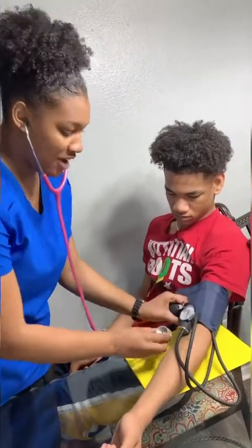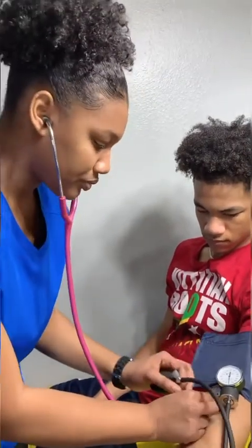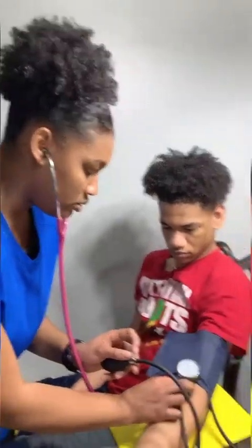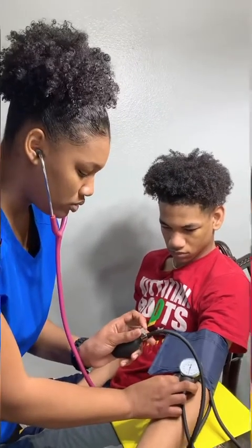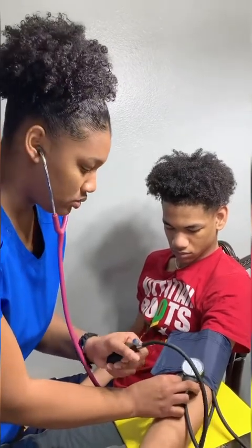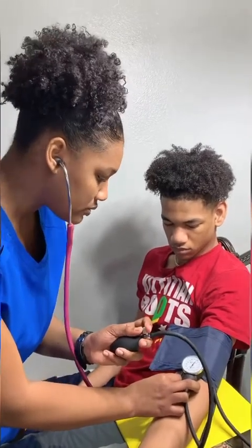So I'm going to have my stethoscope on the brachial artery. Okay, and then I'm going to make sure that I can see the manometer. Okay, so I'm going to turn it clockwise now. Okay, and then I am going to inflate it. Okay, and then turn it anti-clockwise.